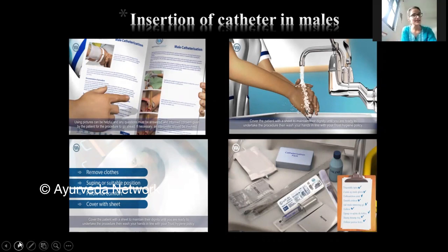The second thing that you can see here is continuous washing of your hands. Even after you touch any article, your hands or any of the articles which you are going to use, you should wash your hands, because you must avoid giving infection or any sort of UTI to the patient. So you should wash your hands after that.